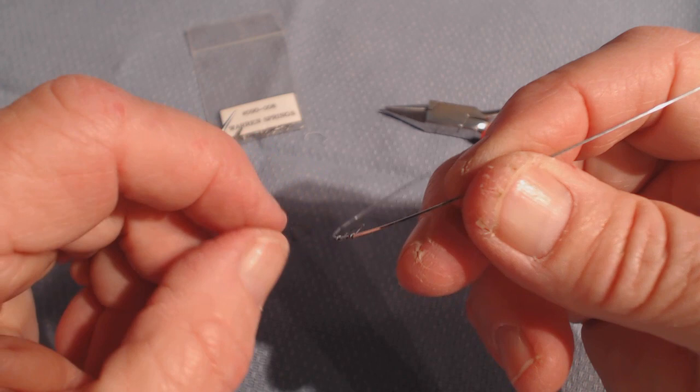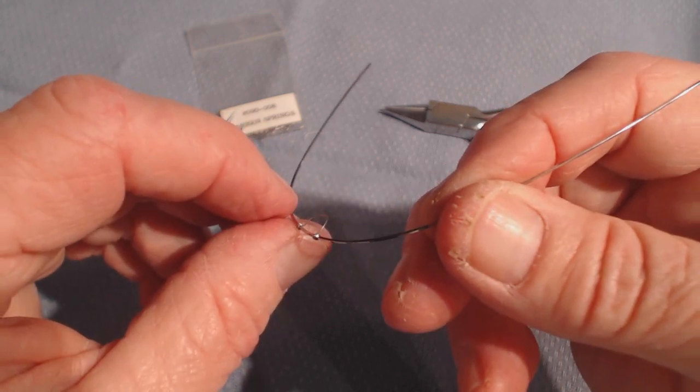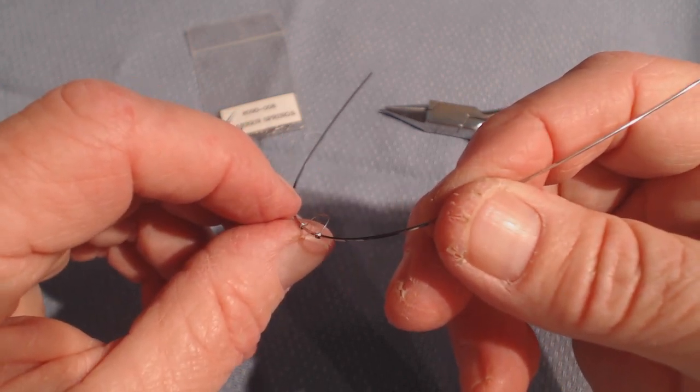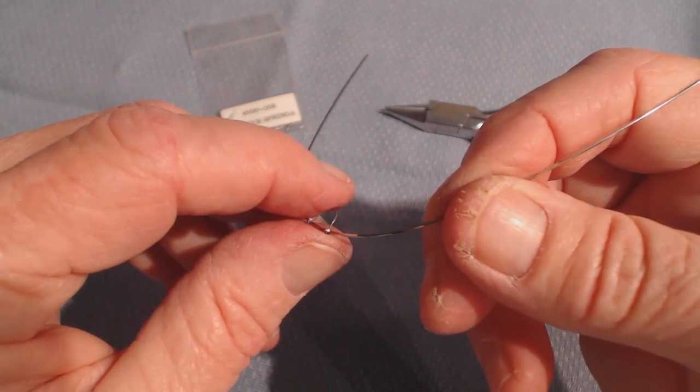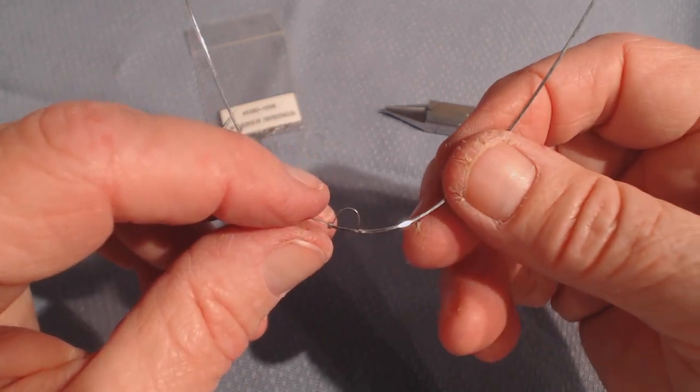This auxiliary is meant to make lingual root torque in a tooth. So, that's the same as buckle crown torque. That's what the tooth would feel. So, the lacing is necessary to make the root go back and not the crown go forward.